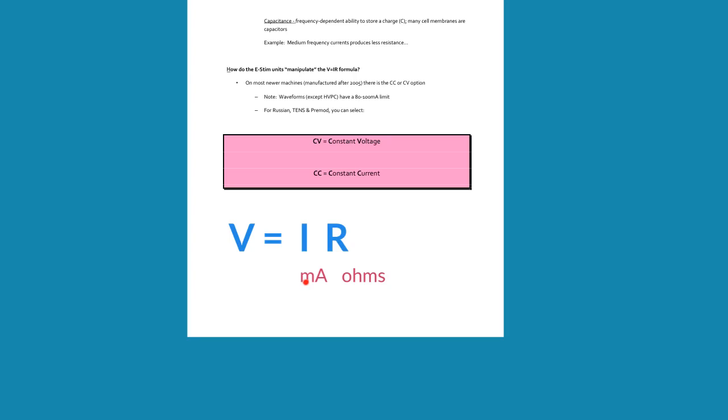However, it may result in significant pain because of the recruitment of sharp fibers. It may also result in muscle soreness and just really uncomfortable muscle contractions and delayed onset muscle soreness the following day. We also know that there's a range associated with cardiac arrest, which is 100 to 200 milliamps. So we want to stay away from that.